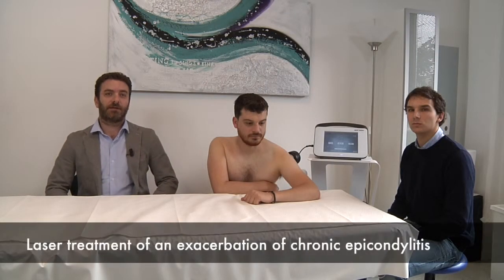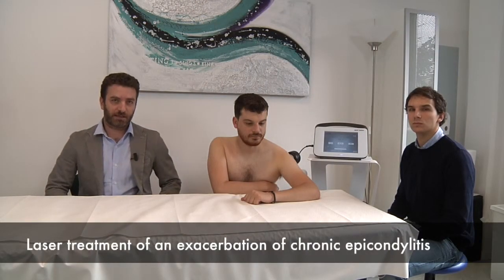We simulate the treatment of a flare-up of a chronic epicondylitis, so we are interested in an effect on the pathological substrate and on the symptoms reported by the patient. As regards the treatment of the pathology, we use an anti-edema effect to promote the removal of the exudate in the interior of the tendon sheath.